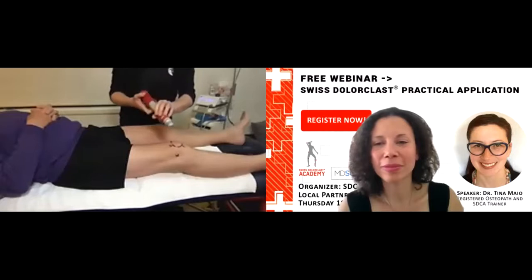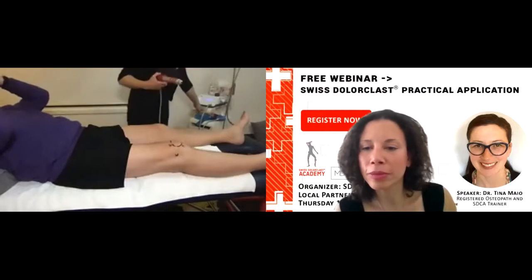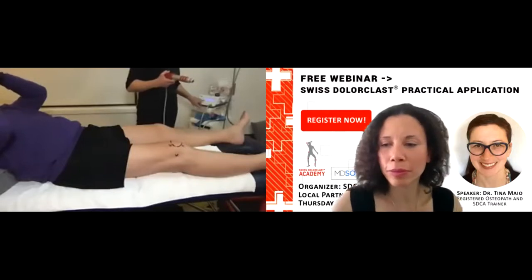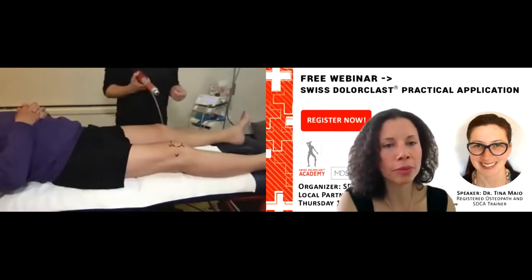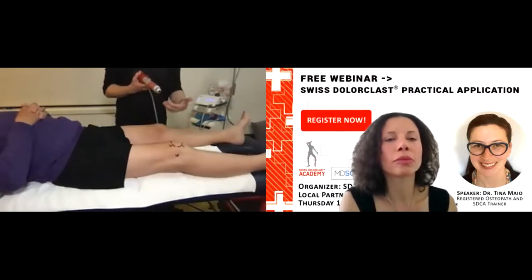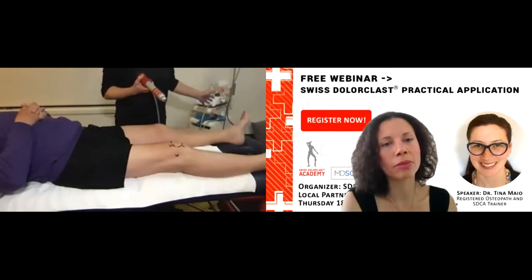So you okay there? Okay, so I'm going to set the machine. We're going to start at 2 bars of pressure. We're going to deliver 2000 with this first lot, and I'm going to set the machine to 10 hertz. We know that below 8 hertz, we don't really get a therapeutic change. And we also know below 2 bars of pressure for this indication, we're not going to get much of a change. So we're going to see how Mark goes, and I'll ask him for feedback as we go, and then we'll determine how much more energy we put into the tissue. Okay. So you ready? Okay, excellent.